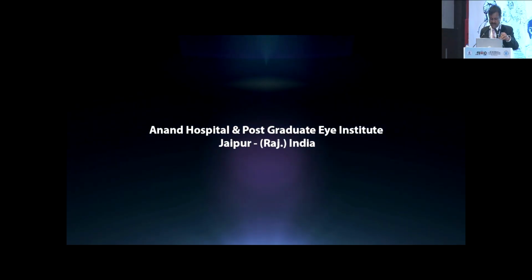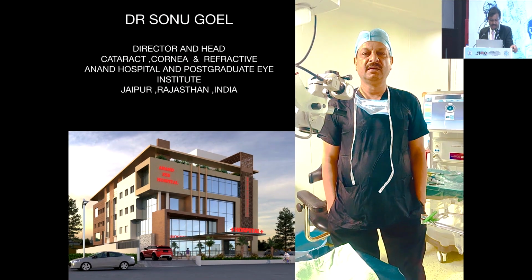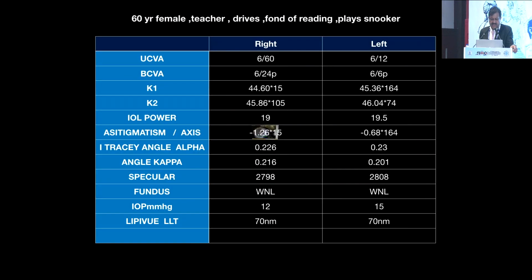Here I'll be showcasing surgery for this 60-year-old teacher, and in fact she's one of the school teachers. She drives, she's fond of reading, and she plays occasional snooker. So actually she wants vision at all three places.